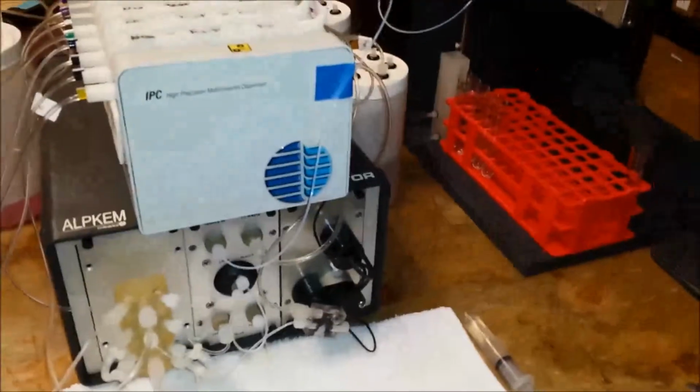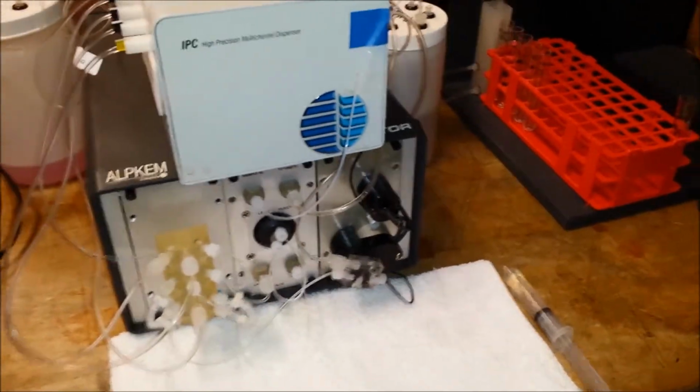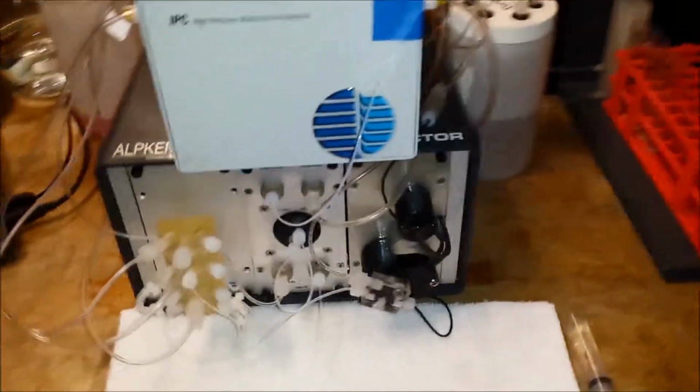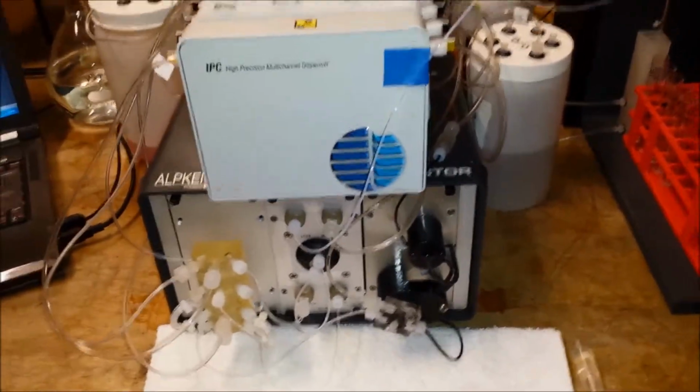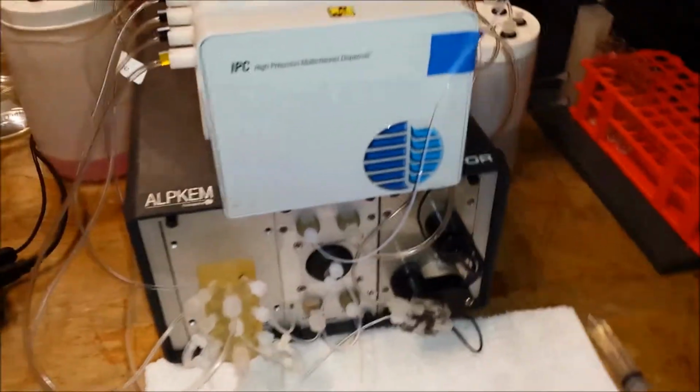Today in our ongoing series of troubleshooting autoanalyzers, we are attempting to discern whether the problem is related to a mechanical issue or a chemical issue. The operator is experiencing no peaks when running. Everything appears to be fine. The serial communication value is fine.